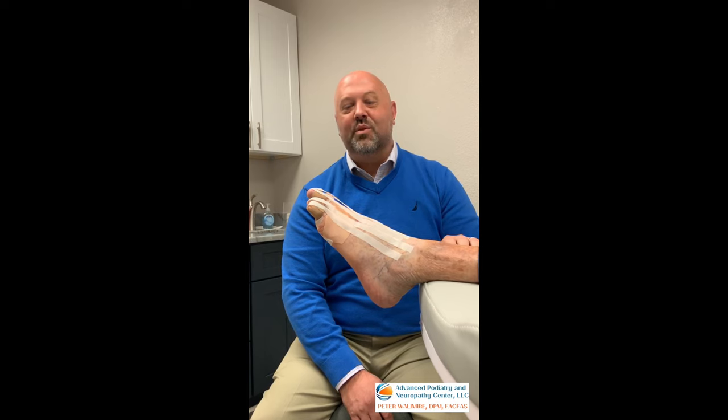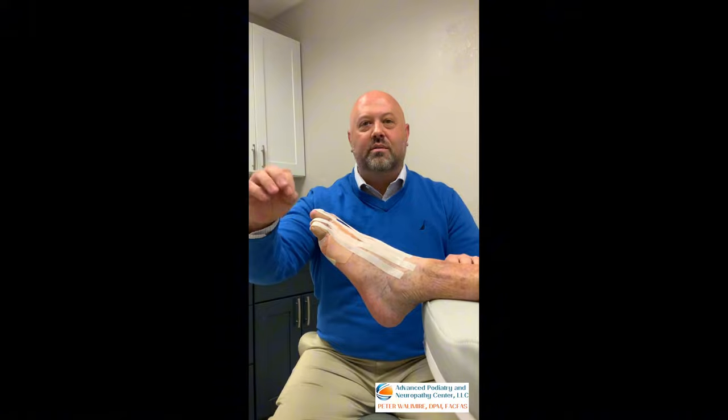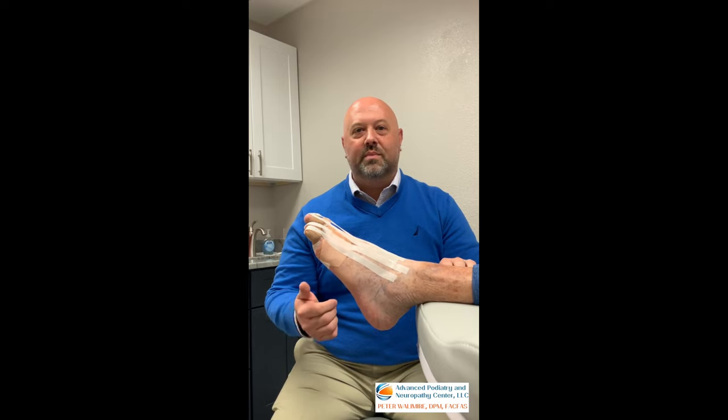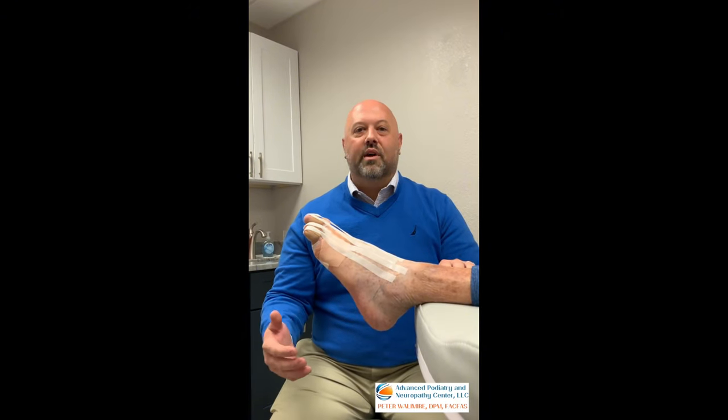As you can see, we've got an amazing correction of these hammer toes with just a few little needle sticks that are going to heal up very quickly. He's going to have almost no pain from this procedure. He's able to walk and be active right away, and he avoided an expensive surgery which would make his toes look abnormal, not able to bend, and also carry with it a very long recovery.